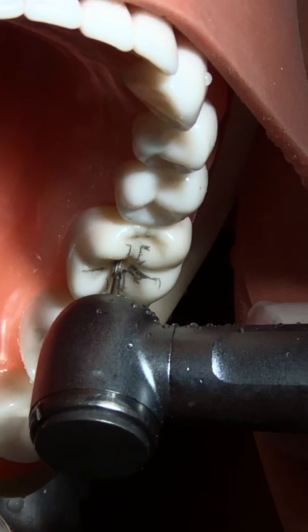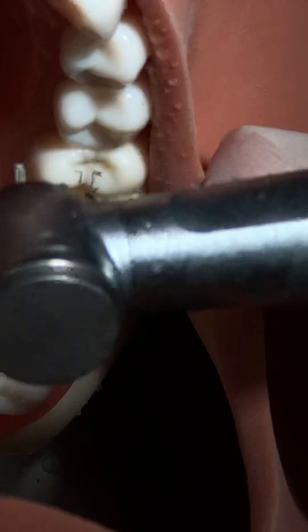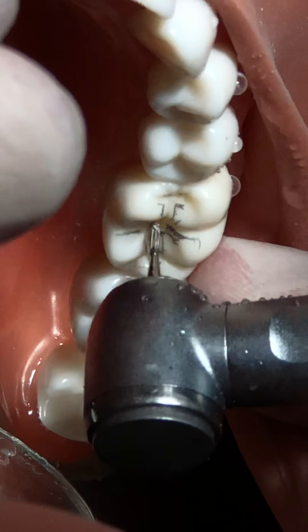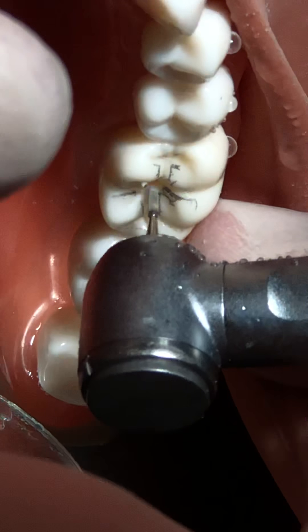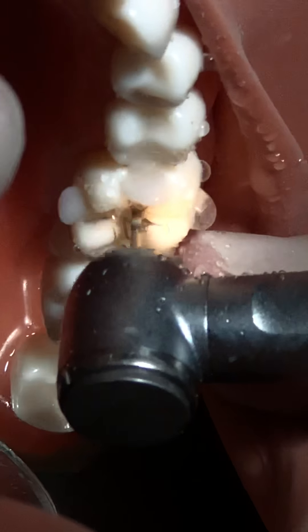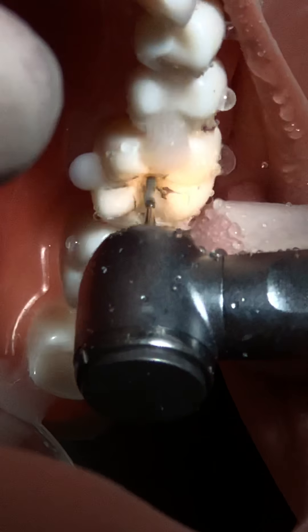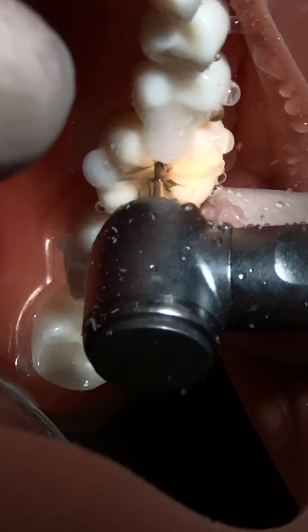The cavity goes almost to 2 millimeters - half of the bur is inside, and this is my indicator to stop here depth-wise. Now I'll prepare a Class 1 cavity as we prepared in the previous session.